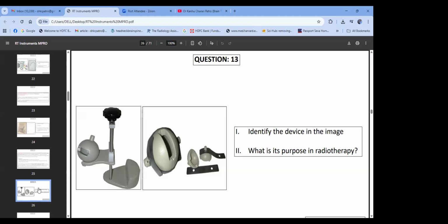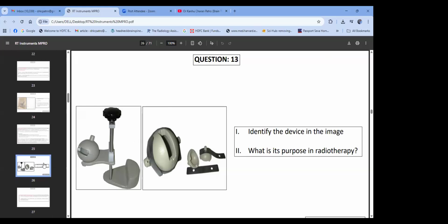So how common is that? When did you last use a testicular shield for a CA rectum patient? I have seen it just once. And then in CSI also, if we are giving. Younger patients, rectum you don't usually see, so CSI probably. But you can also say lymphomas. Yes, sir. Okay.